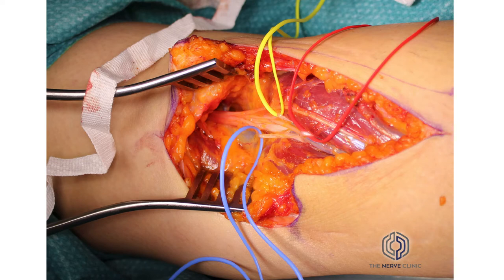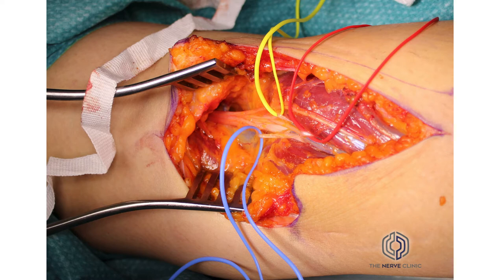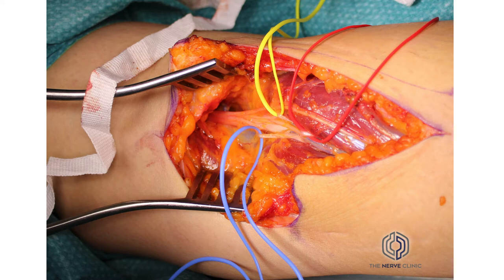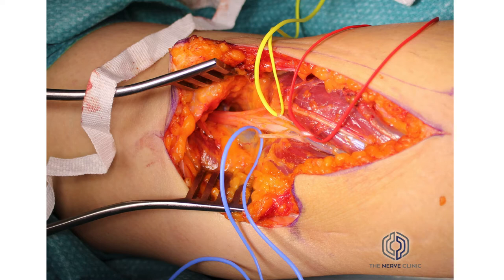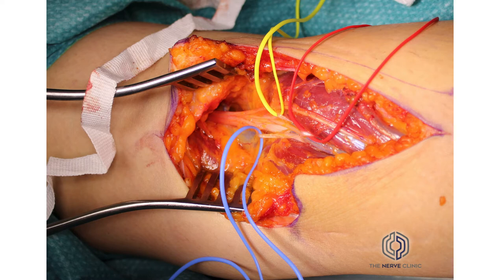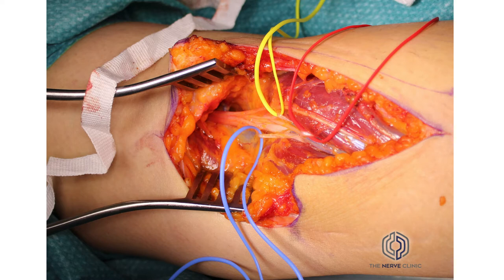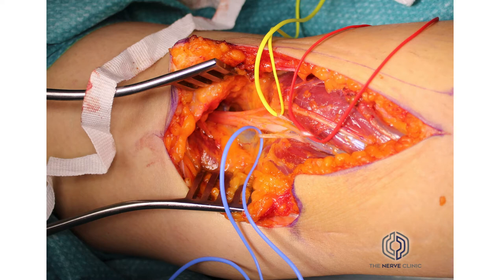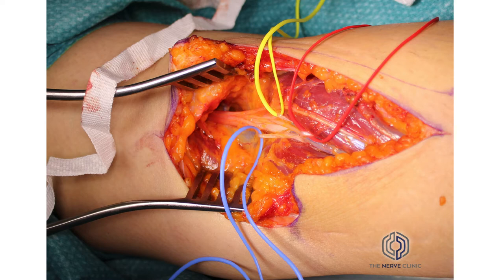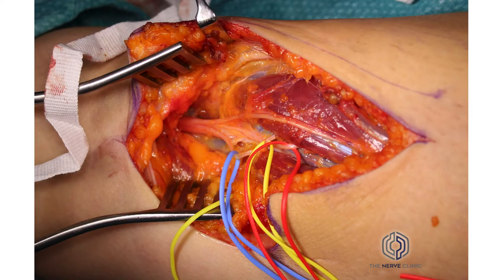The medial head of gastrocnemius is looped in the blue loop, the red loop shows a branch passing down to soleus, and in the yellow loop there is a proximal branch into the lateral head of gastrocnemius. Seen superficial to the lateral head of the gastrocnemius muscle is a sural communicating branch that goes on to join the sural nerve with the branch from the peroneal nerve, supplying the outer aspect of the foot and ankle with cutaneous sensation. This nerve branch must not be injured, otherwise pain may result.